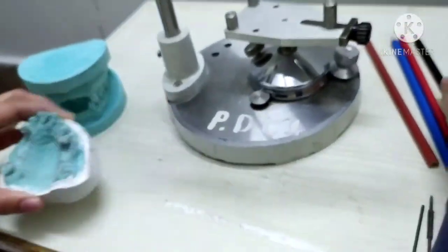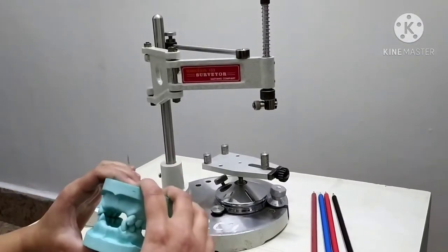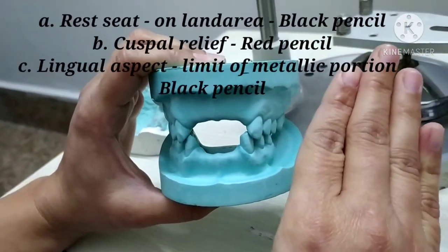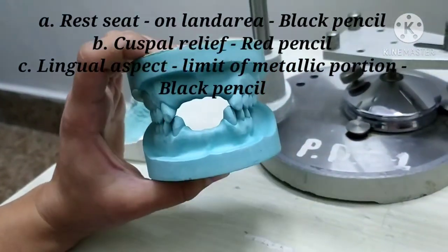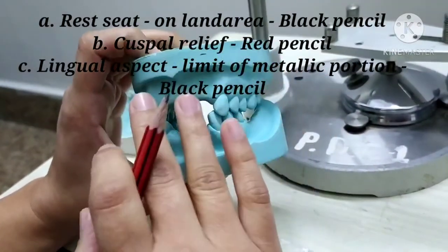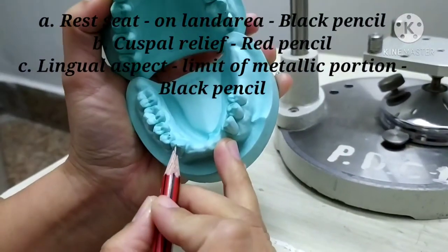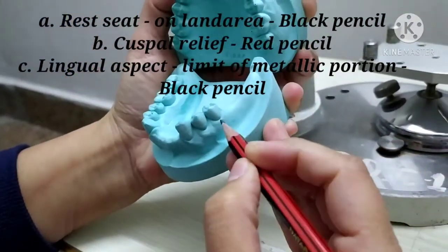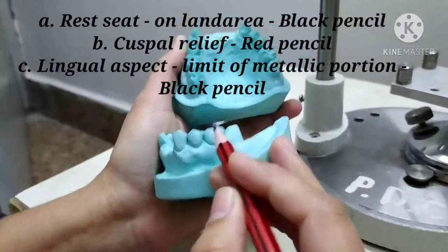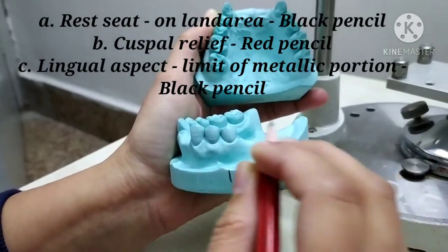Starting with the procedure of surveying, the first step is to examine the occluded diagnostic cast. In this occluded diagnostic cast, three things need to be noted. First, the proposed rest areas have to be indicated by a short vertical line on the land area. For example, if we are going to place a cingulum rest seat on the canines and an occlusal rest seat on the premolar, then on the land area this single line is marked to indicate the rest seat on each tooth.